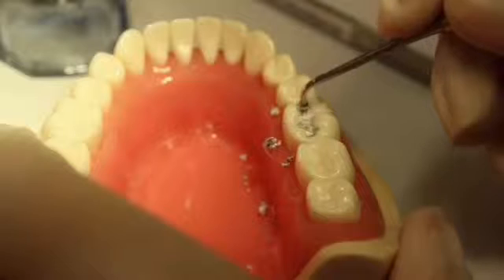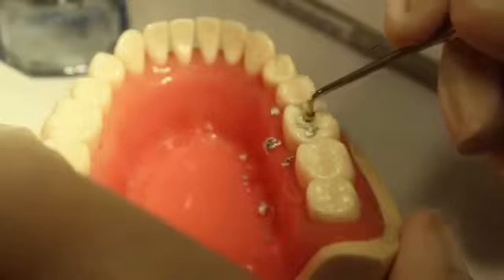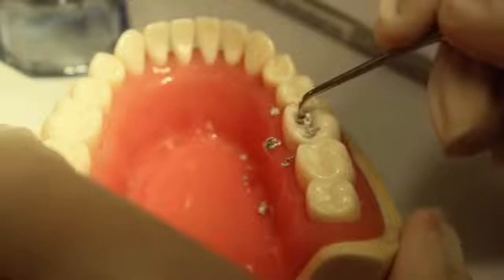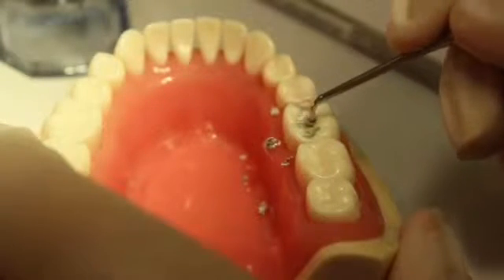Next is pre-carved burnishing. Using a burnisher, spread the amalgam from the center of the tooth outward. It will help remove excess mercury and also adapt amalgam at the margins.